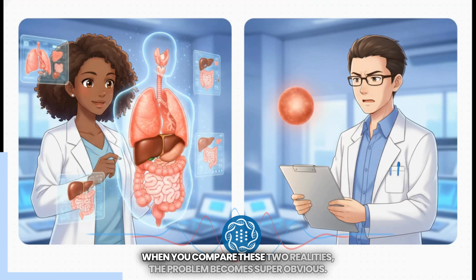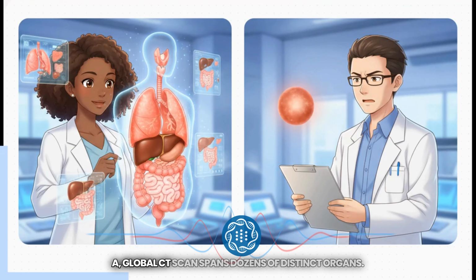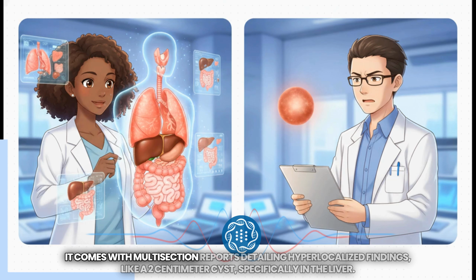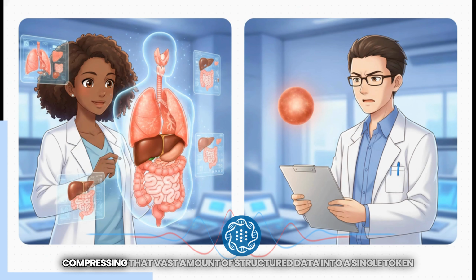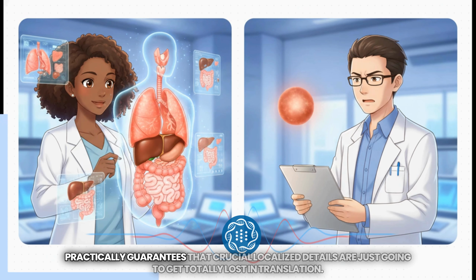That is exactly what standard clip-style models do to these massive 3D CT scans. When you compare these two realities, the problem becomes super obvious. A global CT scan spans dozens of distinct organs. It comes with multi-sectioned reports detailing hyper-localized findings, like a 2-centimeter cyst specifically in the liver. But standard models compress all of these structural axes into one single data point. Compressing that vast amount of structured data into a single token practically guarantees that crucial, localized details are just going to get totally lost in translation.